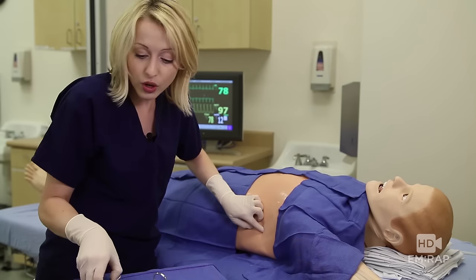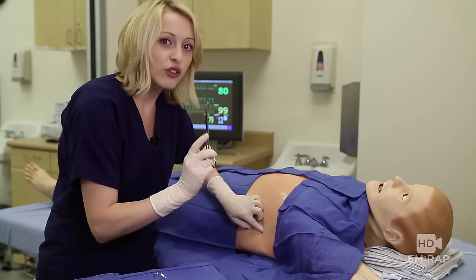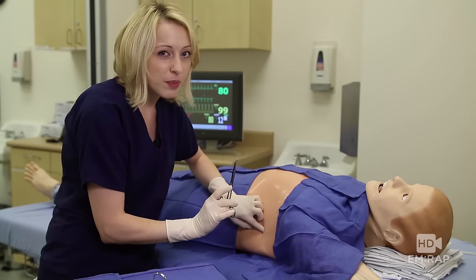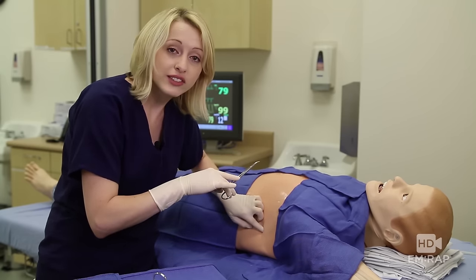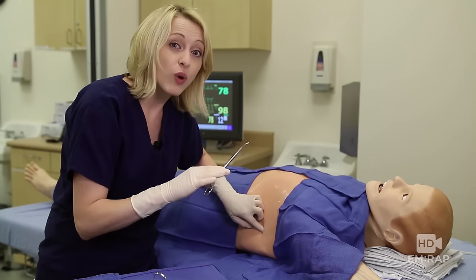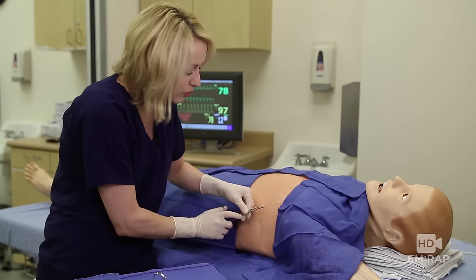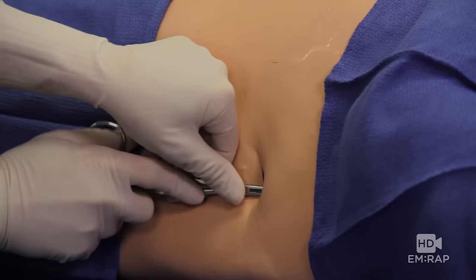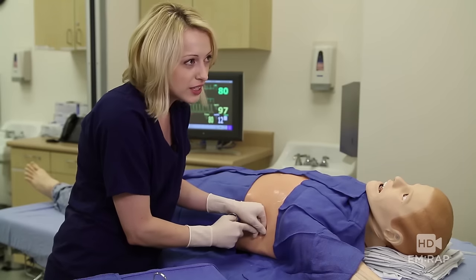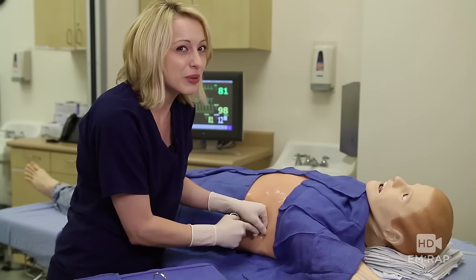Now we're going to bluntly dissect with our small Kellys. Remember we're going one rib space up because there's a neurovascular bundle that sits at the inferior margin of every rib and we want to avoid that. Hold the Kellys so you don't accidentally insert them too far. If you're new at this, it takes more force than you might expect and it really does feel like a pop.